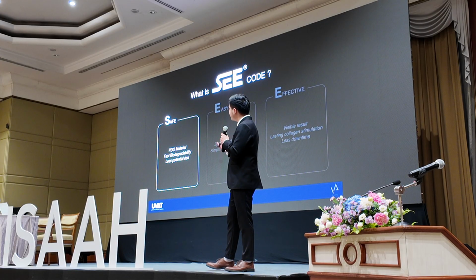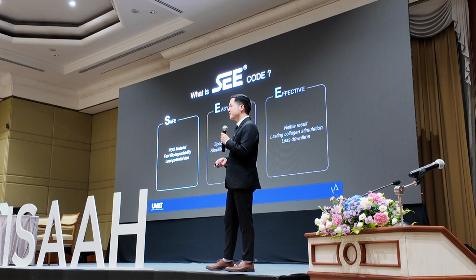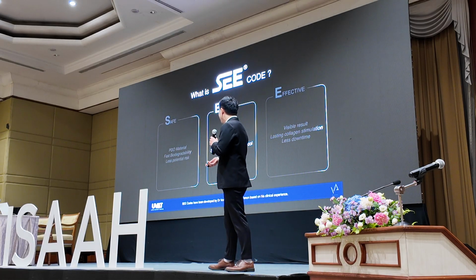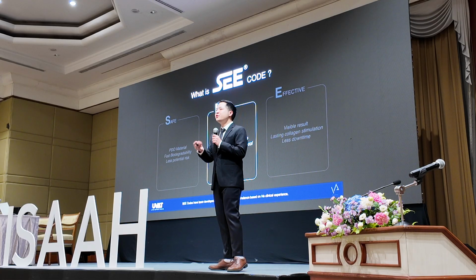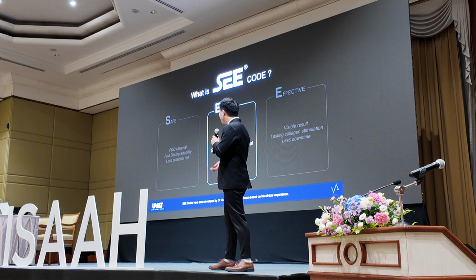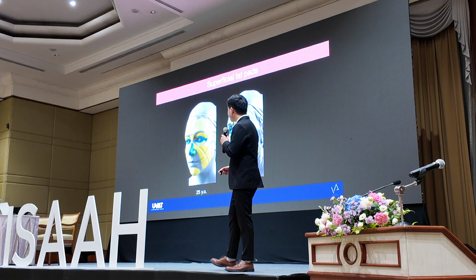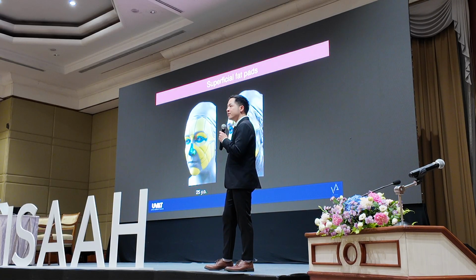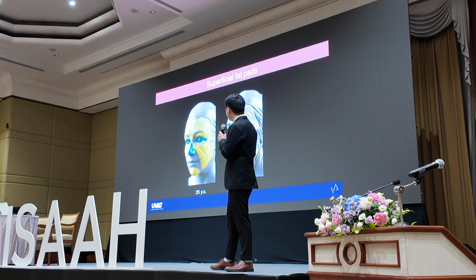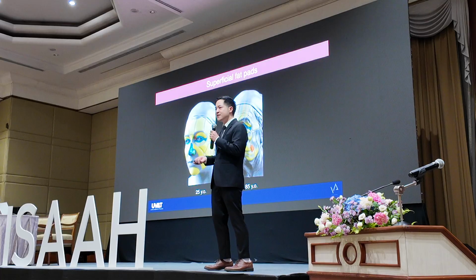We will see what is meant by easy. Easy is about a very easy technique for use. I will help all of you understand that if there is an area of hypertrophy, we will use reduction, right? But in an atrophy area, we will use the volumization technique.